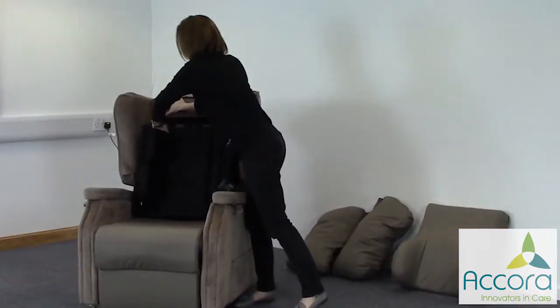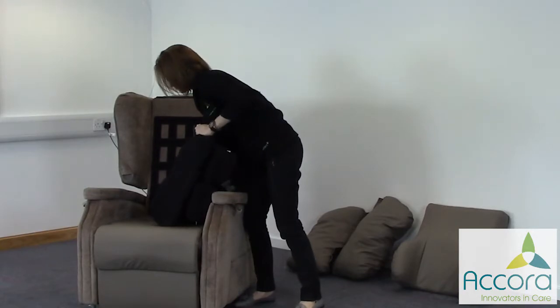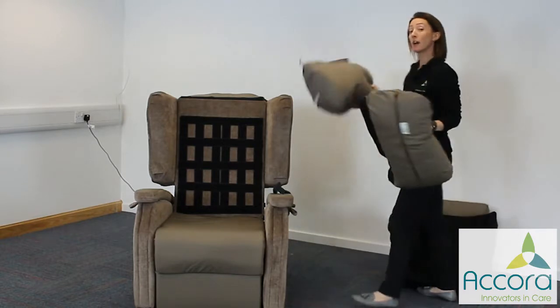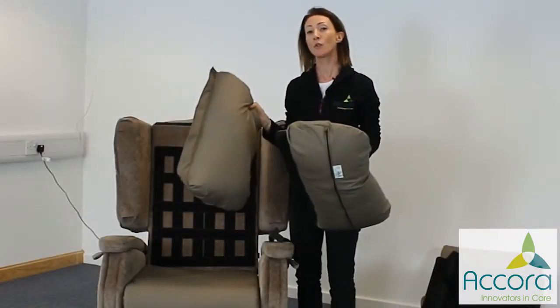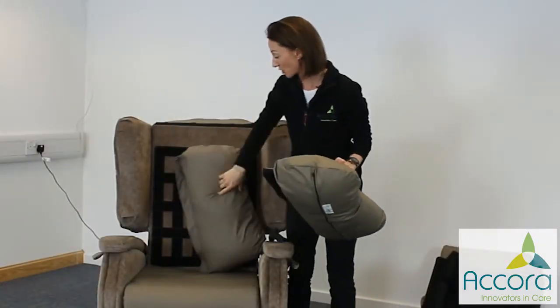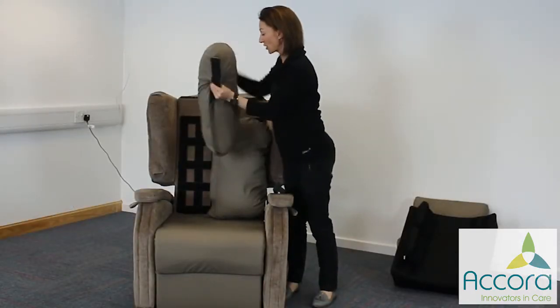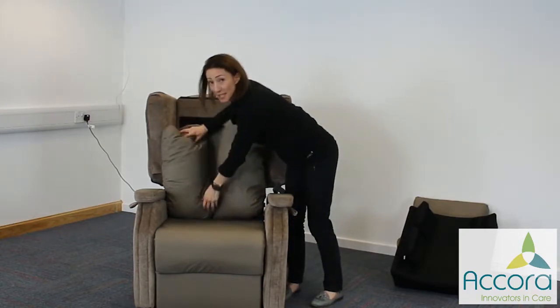The last consideration is for those with a kyphotic spine. When someone has a kyphosis, the apex of the spine can protrude significantly, and what we want to try and do is accommodate that. To do that, what we can use is the Waterfall Backrest in an alternative position. Instead of having them in the normal position, we would put them in a vertical position, and this allows us to leave a gap here for the spine.